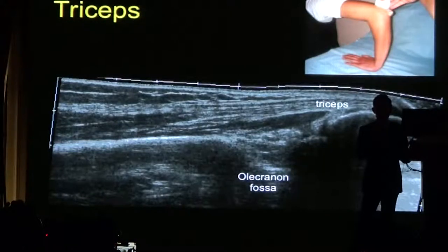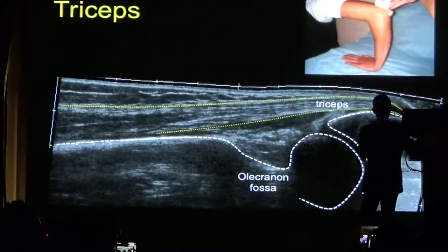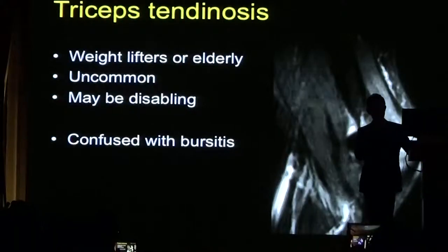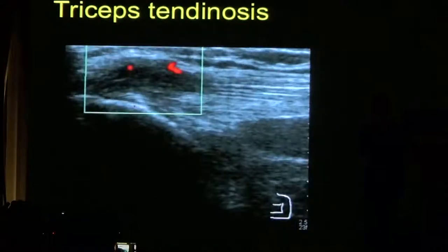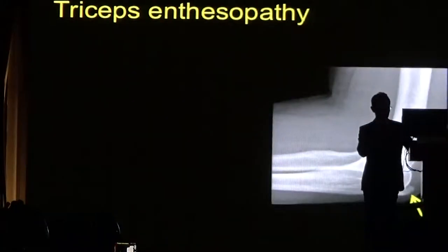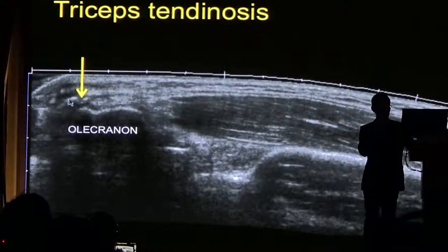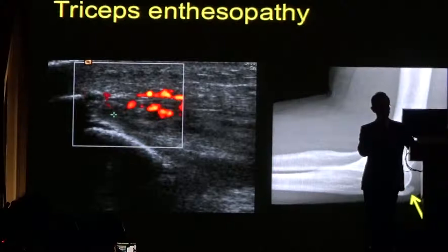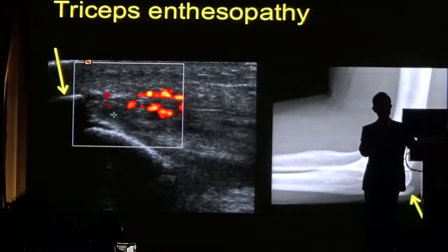At the posterior aspect of the elbow, we have the triceps insertion. Most problems of the triceps will occur as it attaches to the bone. This MRI shows triceps tendinosis with significant stress change within the olecranon. In patients with triceps tendinosis, we expect to see loss of the normal fibrillar pattern of the tendon, with low echogenicity and increased vascularity. Sometimes you may see a bony spur, along with thickening and longitudinal split within the distal tendon.